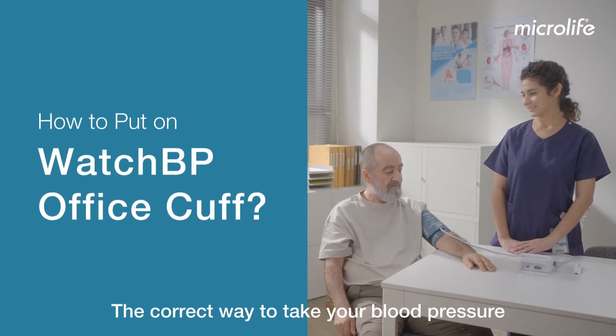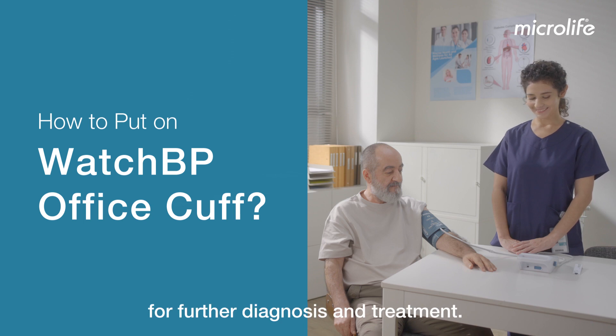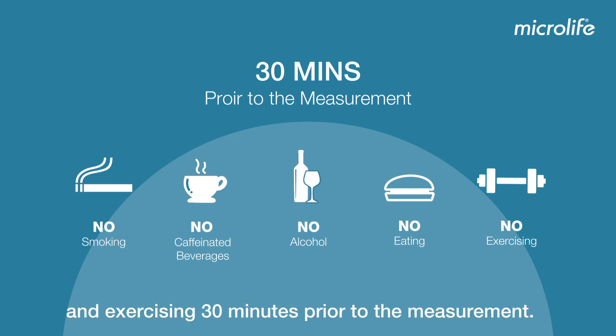The correct way to take your blood pressure is the key to getting an accurate reading for further diagnosis and treatment. Avoid smoking, drinking caffeinated beverages, alcohol, eating, and exercising 30 minutes prior to the measurement.